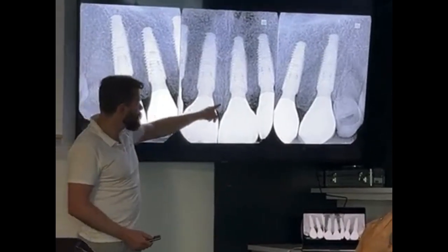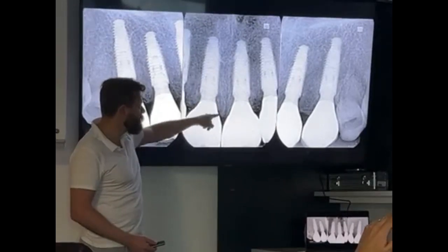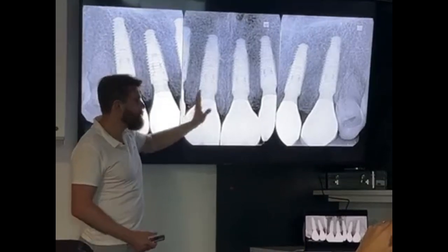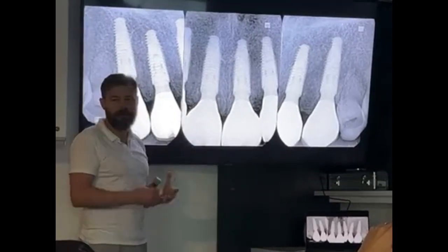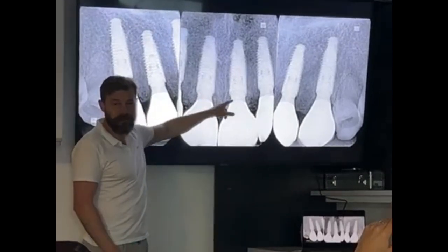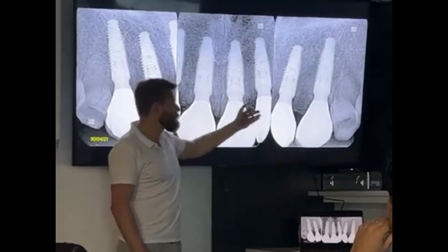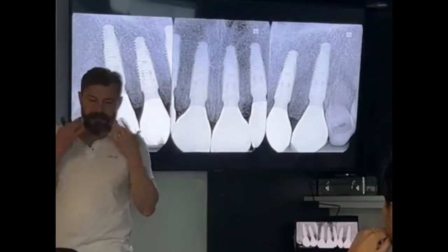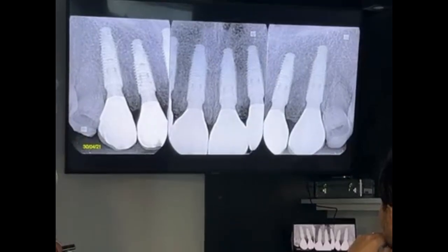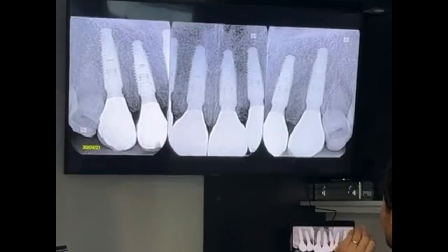If you see the relation between the bone and the abutments here on the Ti-base or even the zirconia area, with the bone, we do not even mention the level of the bone around the implant, because it's not around the implant, it's over. So this relation is beautiful for us to see. That's why I make it possible for you to make 6 implants, one close to each other, because really it's something that you can reproduce on a daily basis if you adopt the same work.